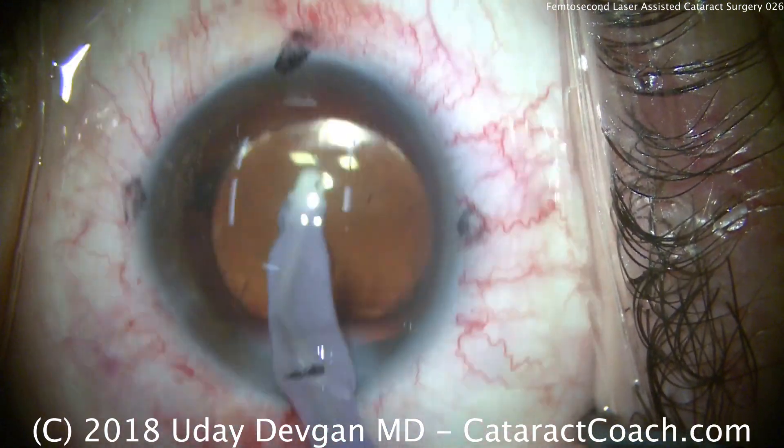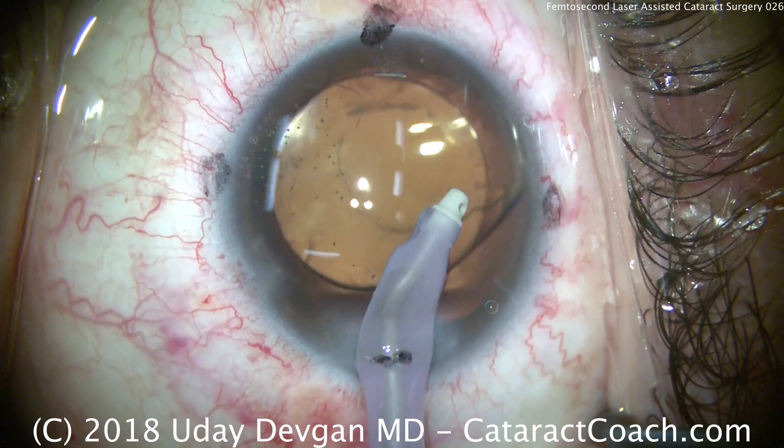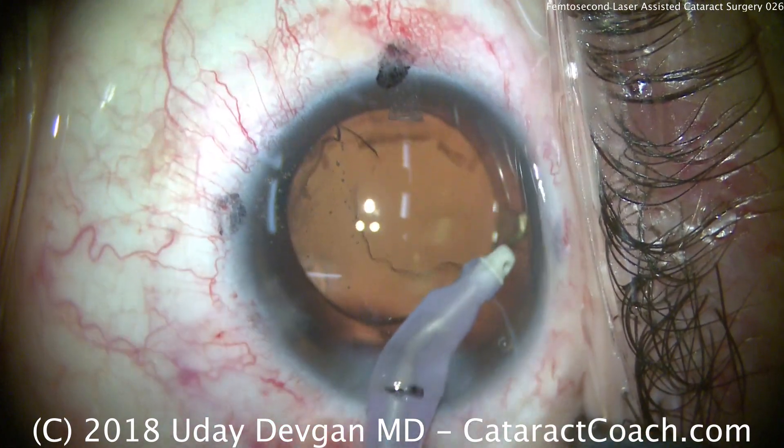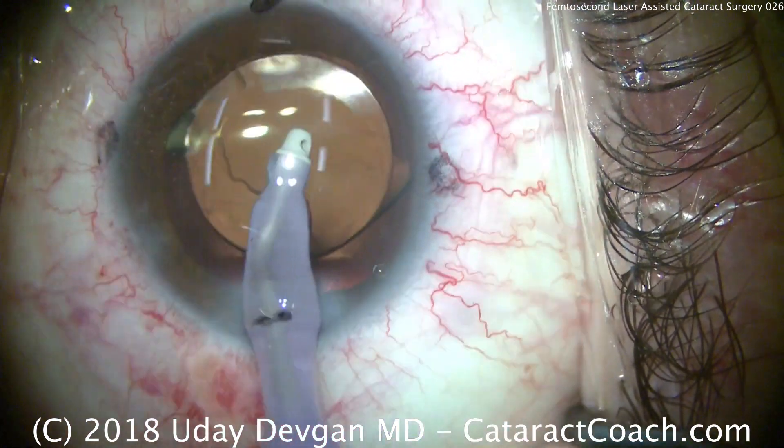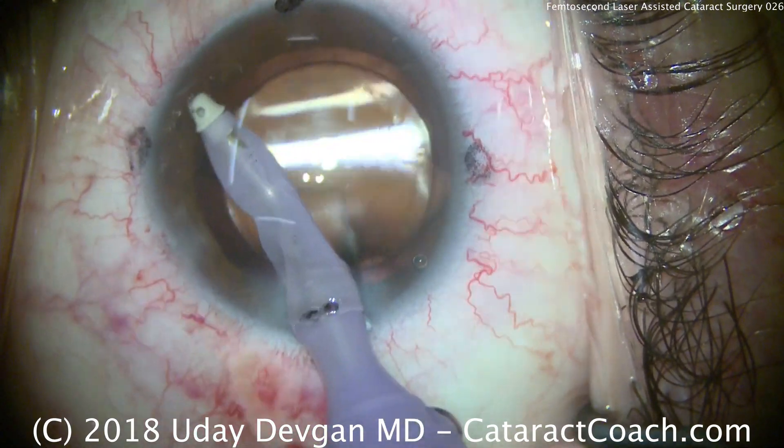The four ink marks visible on the eye are the cardinal meridians, made ahead of time for orientation — particularly important when placing the suction ring on the eye if we're using the laser to create limbal relaxing incisions.